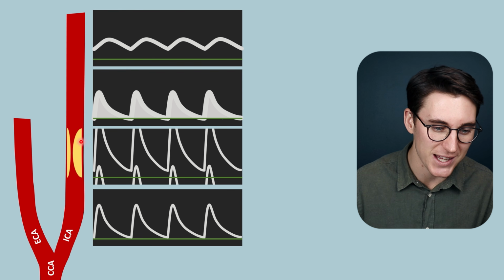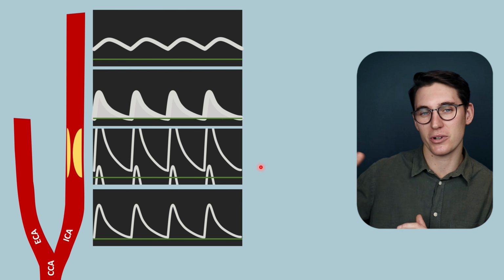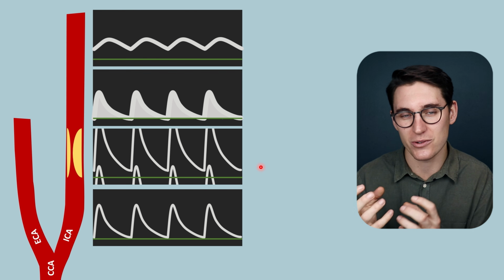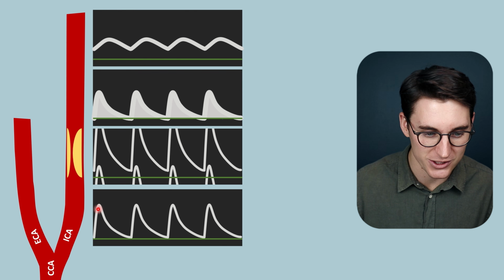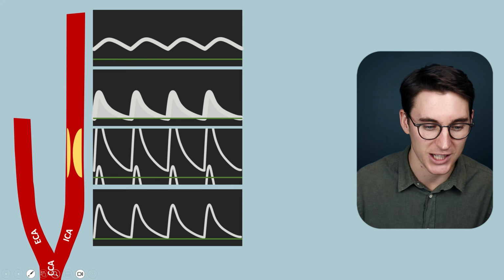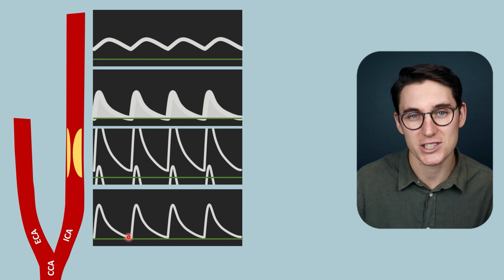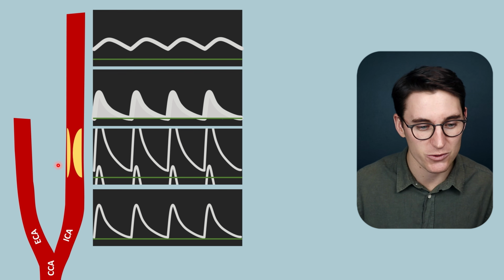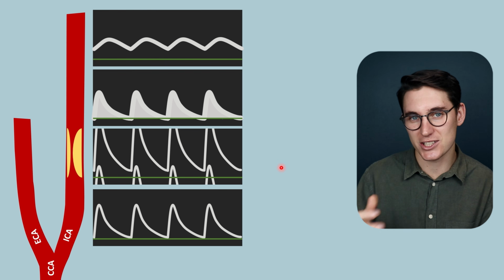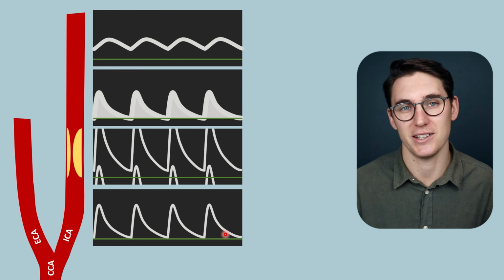We've increased that peripheral vascular resistance. We've seen that as we increase the peripheral vascular resistance, we increase the resistive index of the spectral waveform. So now we are still getting this peak systolic velocity coming from the heart here, but in diastole, that end diastolic velocity has now reduced. It's coming towards 0 here. This resistance from the stenosis is causing that diastolic forward flow of blood to slow down. We are reaching the baseline here.